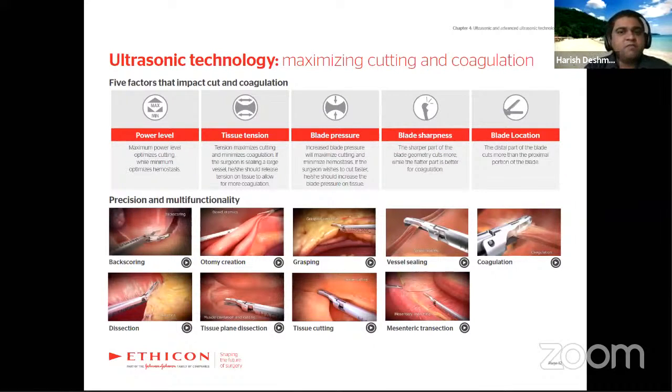During a surgery, Harmonic is always kept at 3 to 5. 3 gives you a balance of cutting and coagulation. 5 will give you more cutting speed. Suppose you are going through an avascular plane, you can use maximum mode and go around with dissection. But when it comes to a vascular plane, you can come down to minimum mode.